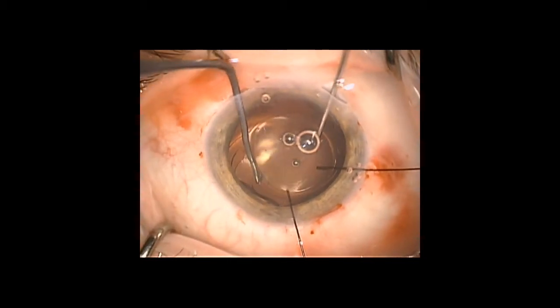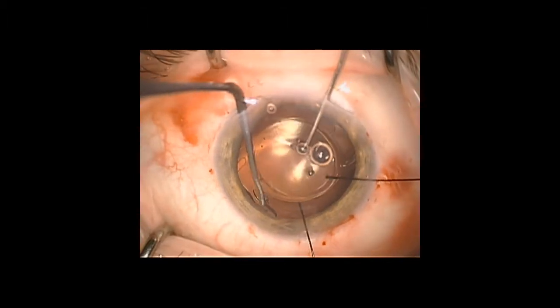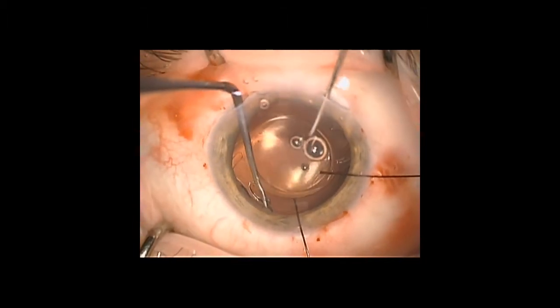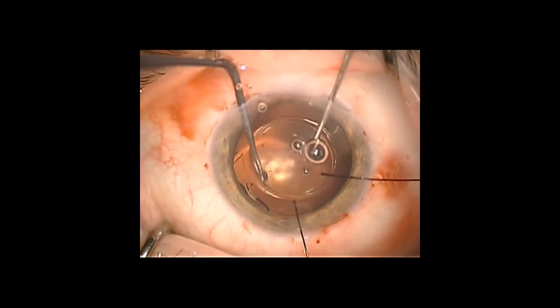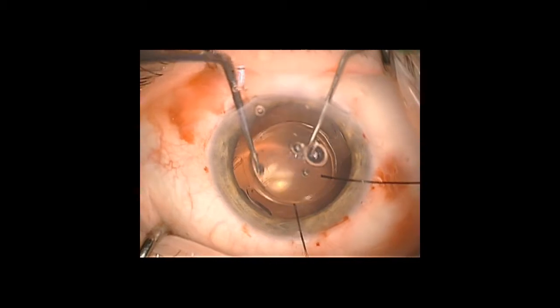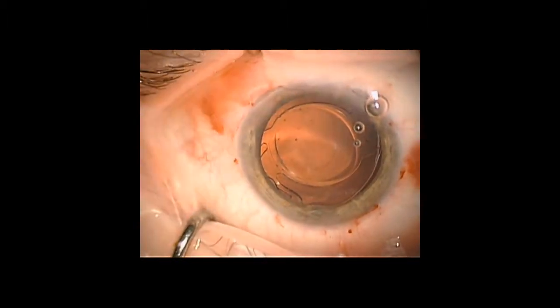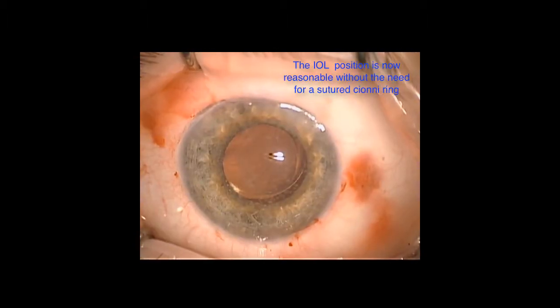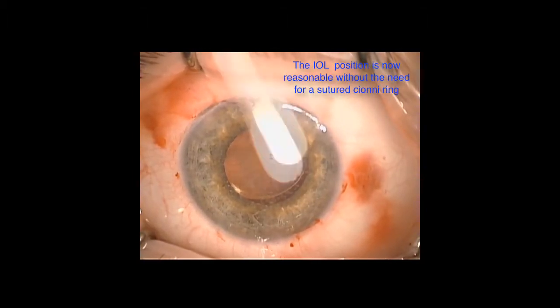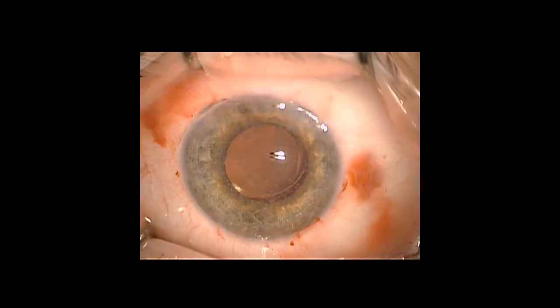A two-handed approach is then utilised to rotate the toric lens into the appropriate position. This again safeguards the weak capsular bag. The iris hooks are then disengaged from the anterior capsular edge, and the final position of the lens is carefully assessed to ensure that there is not any significant further subluxation away from the known weak area of zonules.